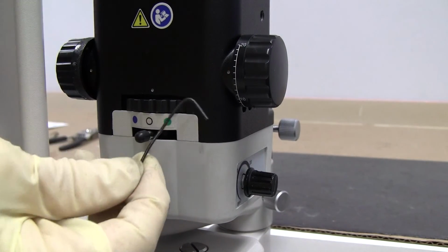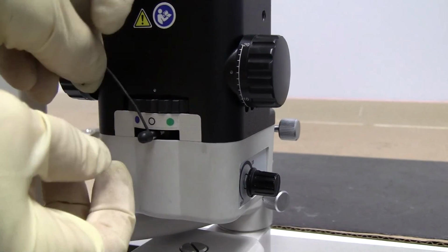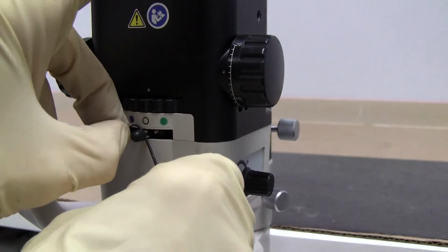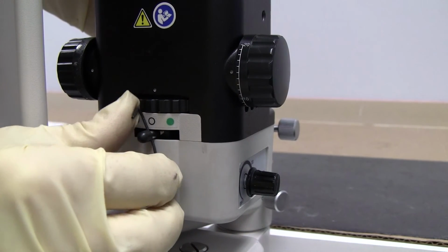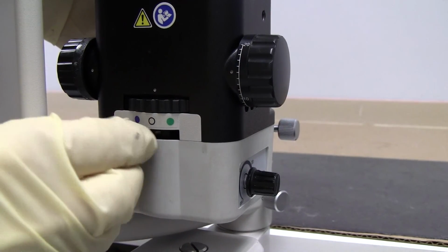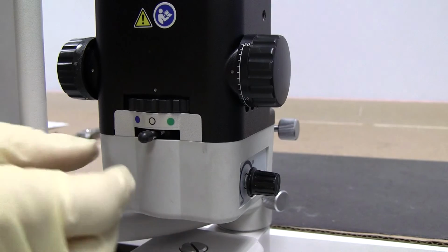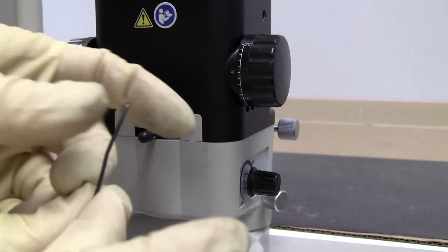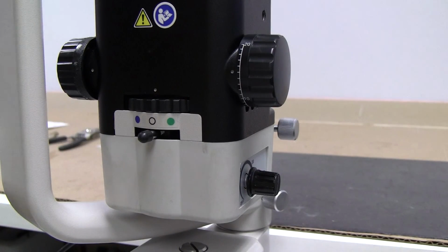Don't forget to tighten it up with whatever you're putting it in here. Tighten it up. And put your cap back on. And if you had put a little polish on the threads, it might help it from coming loose again, but if you tighten it, it should stay on there. If you put a little bit of torque on there with something like this, it should stay there.